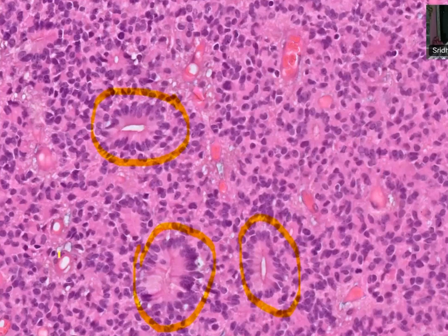Sir, actually these are true ependymal rosettes. Why true ependymal rosettes? Because the lumen is free. So you have a luminal outline here, and cell-free and nuclear-free zones around, with the nucleus pushed to the base. These are canalicular rosettes, likely true ependymal rosettes. Sometimes it is very difficult to distinguish them from other rosettes. Sometimes the lumen space will be small, so you have to use the word canalicular. When you have a very well-defined internal luminal membrane, that is what is canalicular. In this case, true ependymal canalicular rosettes.